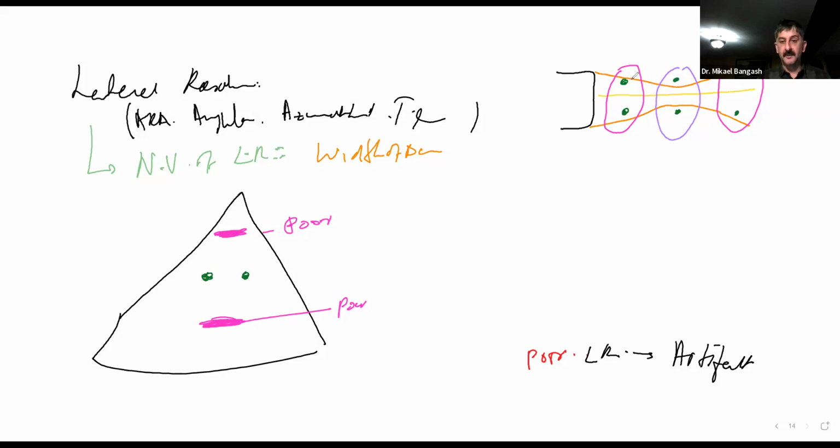If the distance between the two reflectors is less than the width of the beam, the numerical value, then you end up with poor resolution, or poor lateral, angular, azimuthal, or transverse resolution.